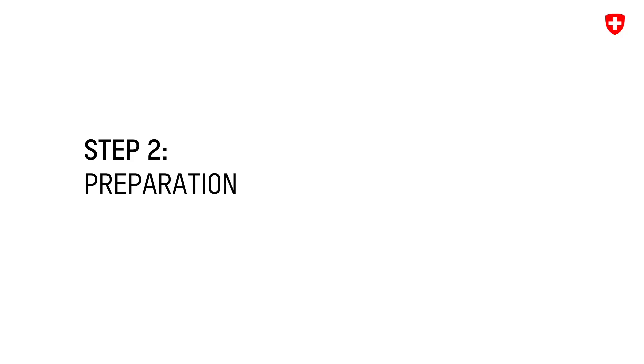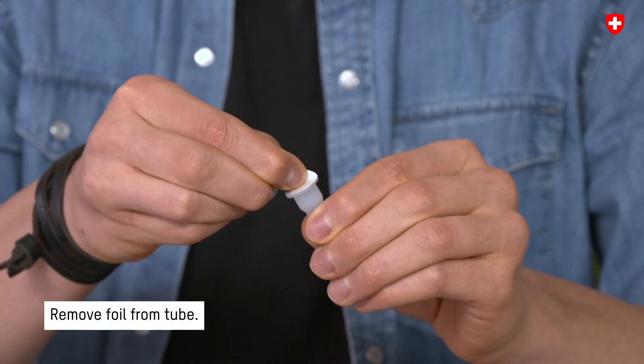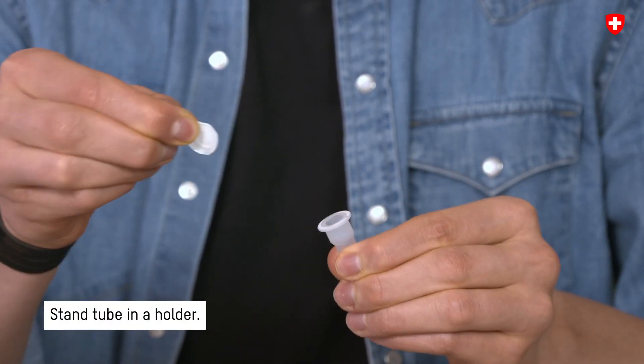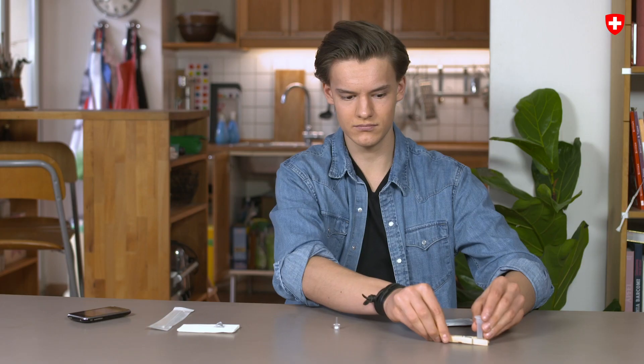Step 2: Preparation. Remove the foil from the tube and place the tube in a holder. The buffer solution is in the tube.